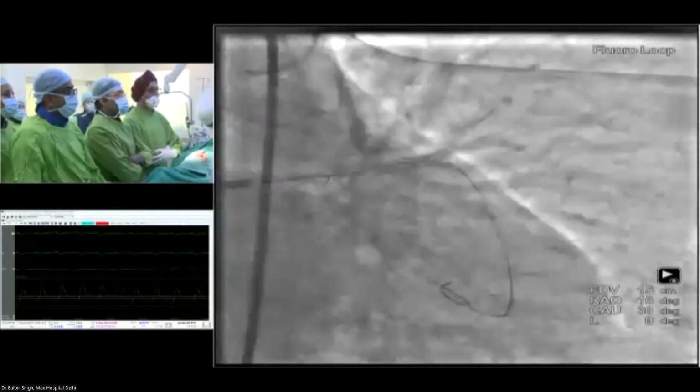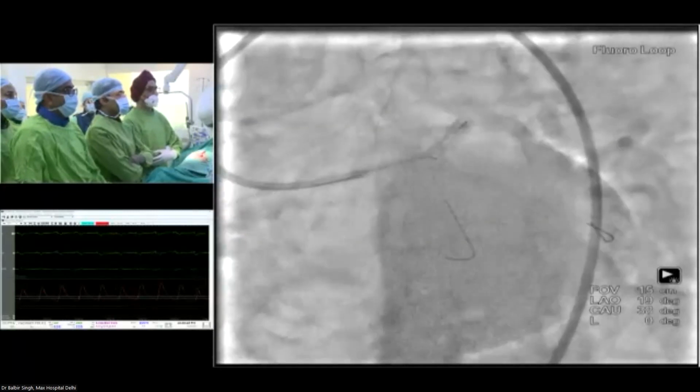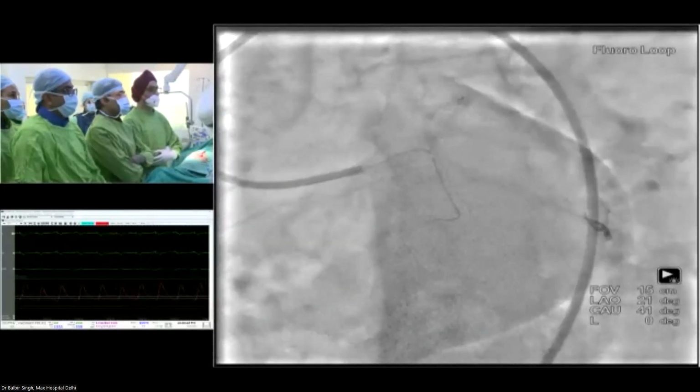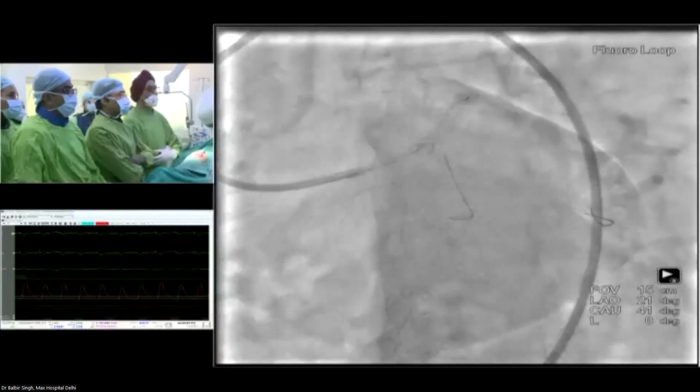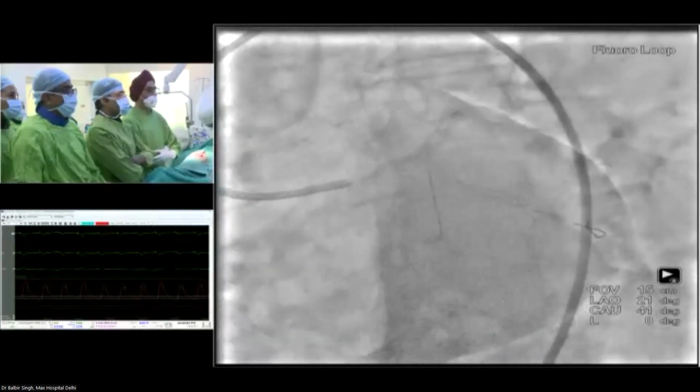So I recrossed at that stage, even before POT. I thought my proximal part of the stent is well placed, well opposed. So I took a wire. This is the Whisper wire again. And you can see mild difficulties, but able to recross quite easily.